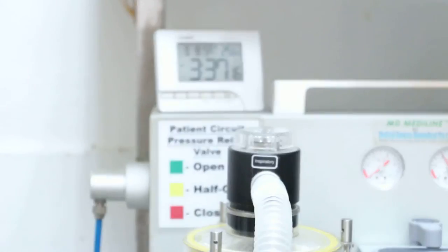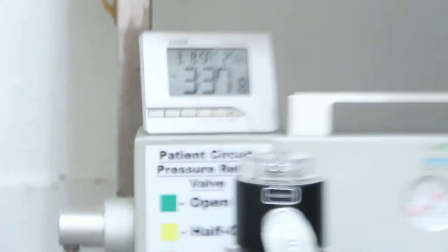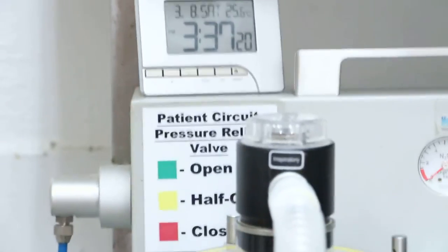The dog is sleeping. This surgery shouldn't take a long time — starting at 3:37 and should finish in less than 4 minutes. Starting now.